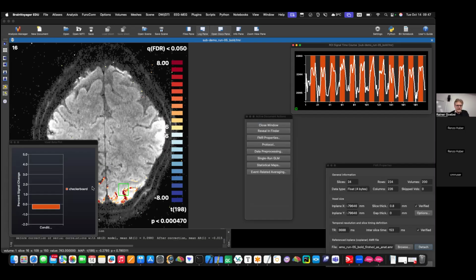And what you see on the left side, which flickers around, is basically the beta. It shows you when you go with your mouse over it. You just zoom a bit in. So if I now go over any voxel here, the beta is 11. It's huge, right? Actually, it's percent signal change because I convert this automatically. You can change that, whatever you want to see. But now I do percent signal change. It's huge. So of course, checkerboard visual stimuli, they are really strong.